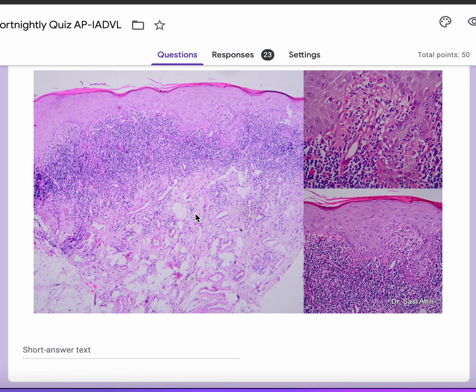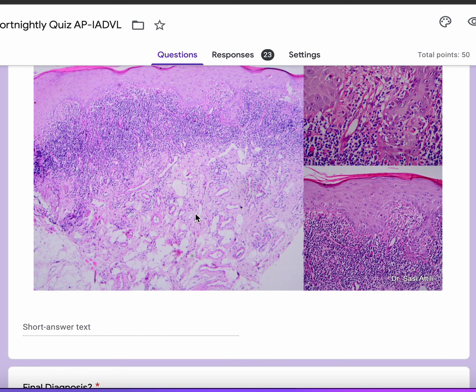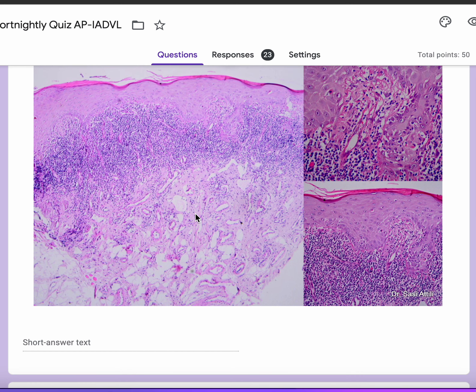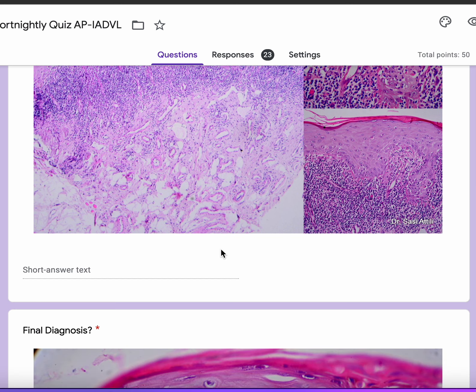On low power you can also confirm that this biopsy is from the lip, because there are a lot of blood vessels here which the lip usually has, and also the fat is quite superficial, which you would expect in the lip.